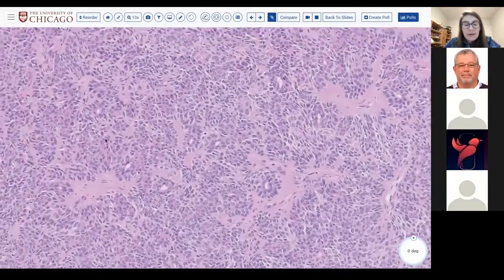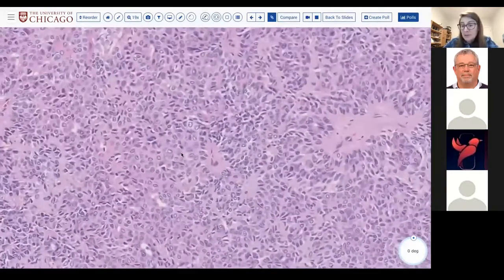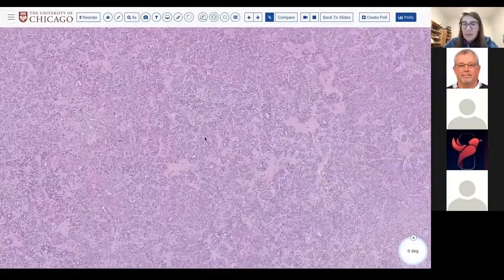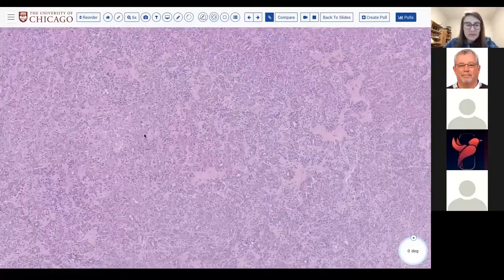So when we think about biphasic neoplasms, what comes in? I'm going to type stuff in the chat. What comes to mind? Pleomorphic adenoma, adenoid cystic carcinoma, epithelial myoepithelial carcinoma are ones. What else? Even perhaps some might argue basal cell neoplasms. So if you're thinking, probably the nearest thing on the differential for this case might be an epithelial myoepithelial carcinoma, because it doesn't quite have the morphology of adenoid cystic or even of a basal cell neoplasm.